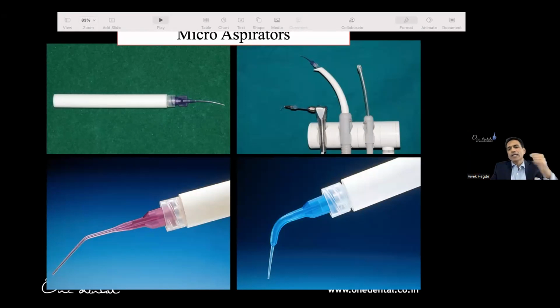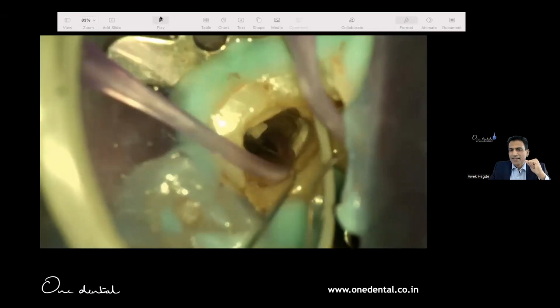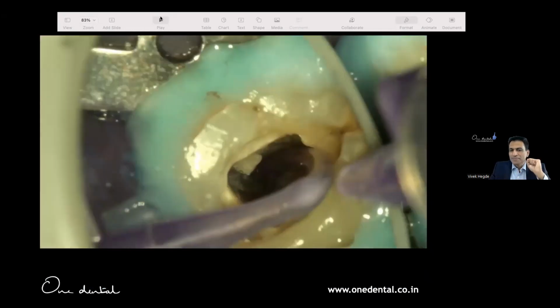And what we do, I tell my assistant, please hold it in the floor or into the canal, and I will hold it for you and show you where to, and don't move after that. And now you see. Now I'm going to irrigate. When I irrigate, the 2 cc, 5 cc, 10 cc hypochlorite doesn't matter. There's rubber dam anyway, but nothing is going to come out. See how the irrigation happens. I'm talking when I'm working. And then you dry the canal. You wait there longer.